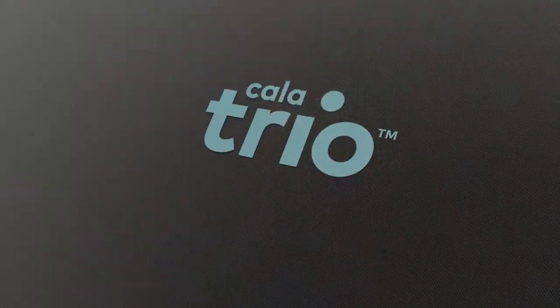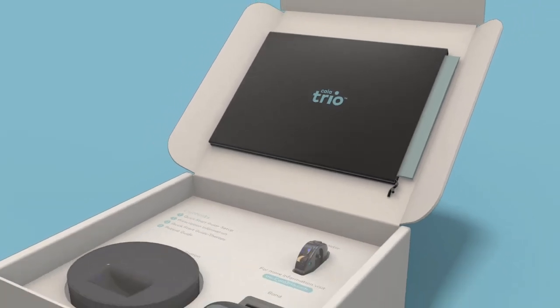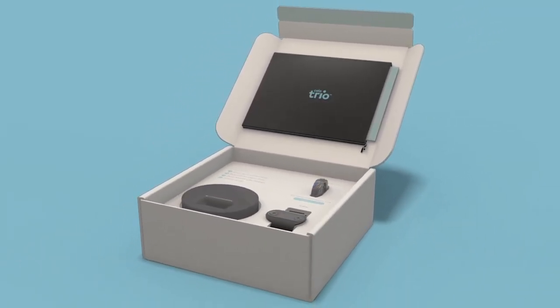Welcome to getting started with Calatrio. In this video, we're going to demonstrate step-by-step how to set up Calatrio to control your essential tremor. Are you ready? Great, let's get started.